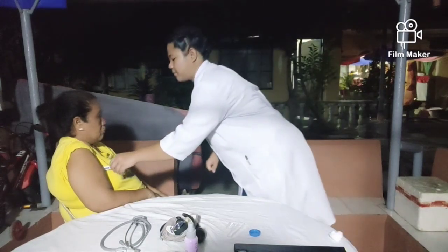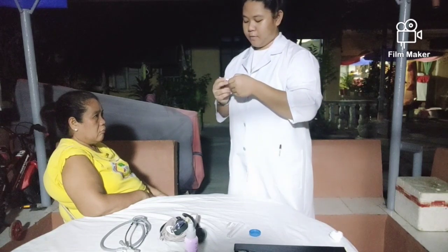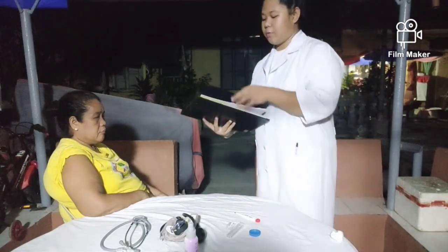Then, record the temperature of the patient.